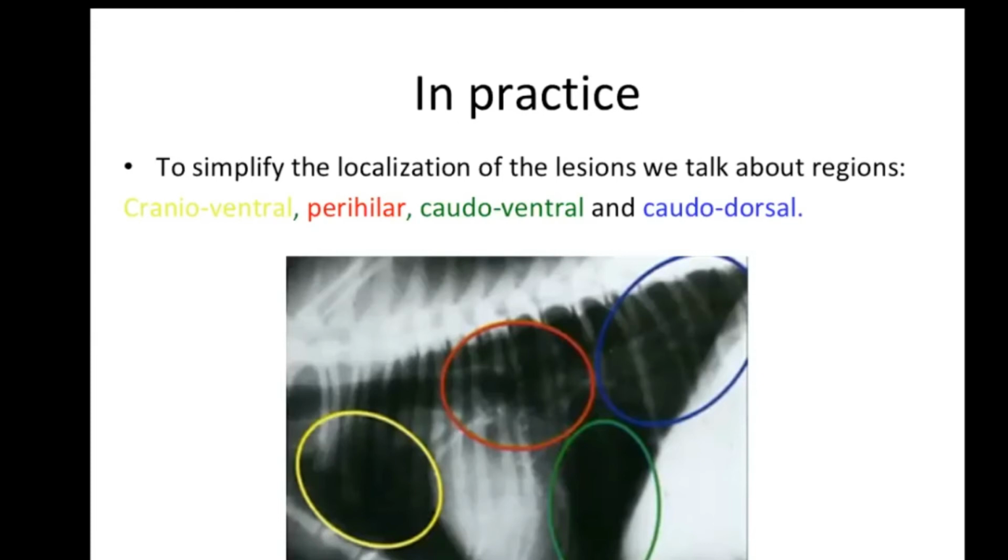It's not one word, like "this animal has infection." You have to say the pattern here, the location, and then say it can have an infection.